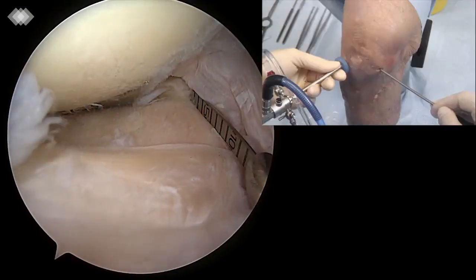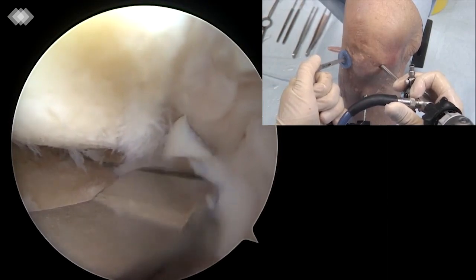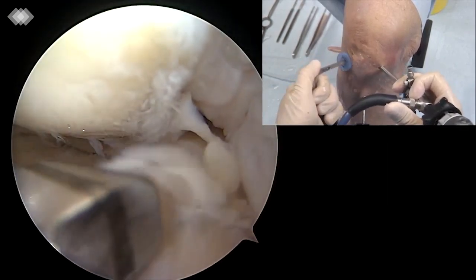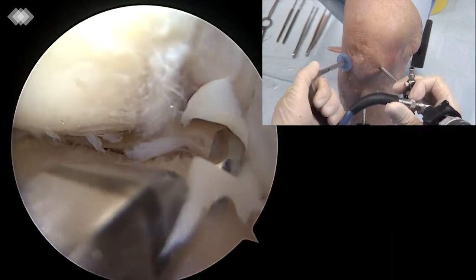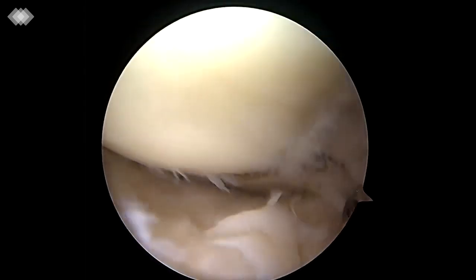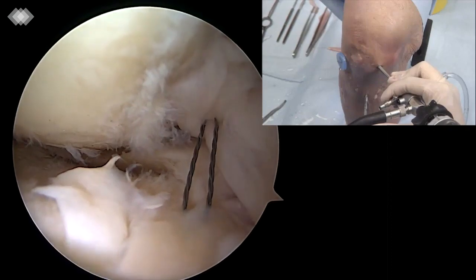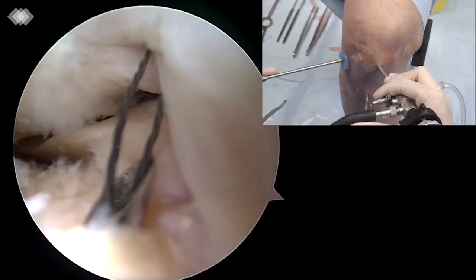The distance between the anterior and posterior meniscal root insertion is measured with an arthroscopic measurement probe introduced through the anterior-medial portal. Using a meniscal hook marking hook, a 6mm flip cutter is drilled through the anterior-lateral cortex of the tibia to 1cm anteriorly to the posterior attachment of the medial meniscus. A 6mm tunnel is then created.